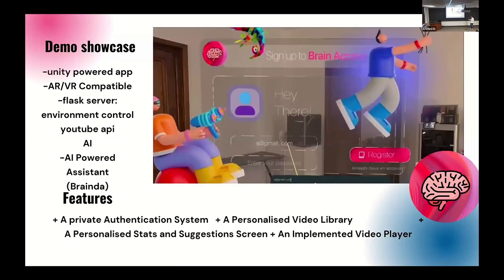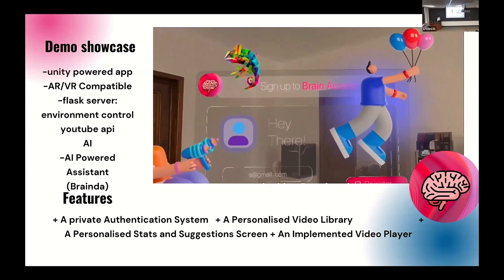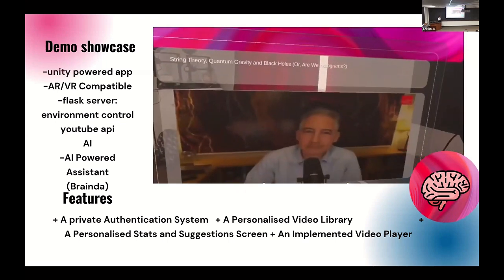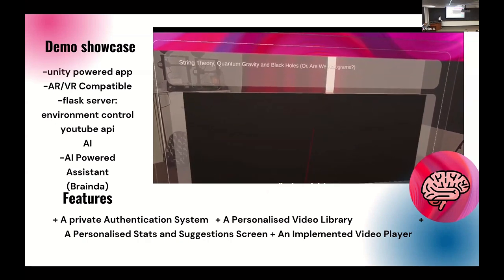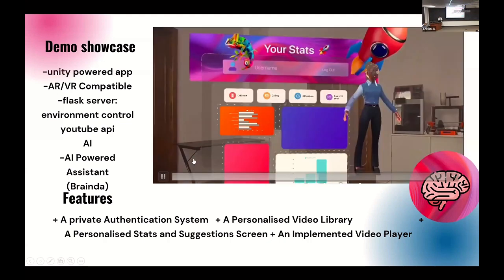And here we have a video demonstrating our platform and how we record the data. Here we recorded some visual exercises, giving a video to relax them at first. Here you can see the user logging into our platform. Here they are choosing a video, for example, on black holes. After seeing that they are not concentrated, it will start beeping. And after that, we can start recording the data.